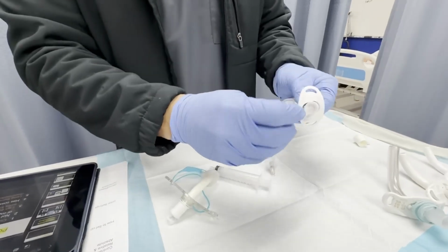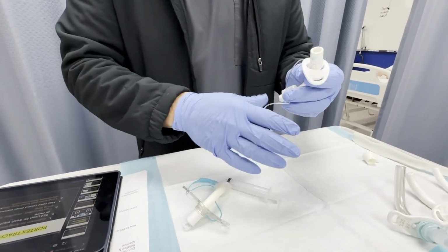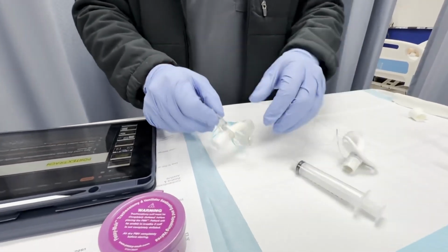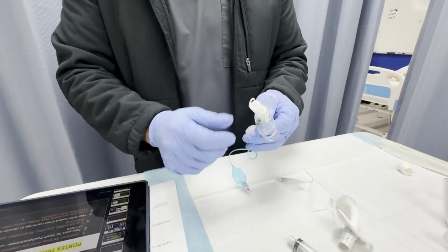This one is a Shiley, like I mentioned, so the inner cannula is disposable. You take that out and just swap it for a new one when you need to. Over here we have a similar one. It's going to be cuffed also, but this one's a Portex. So this would be for long term.